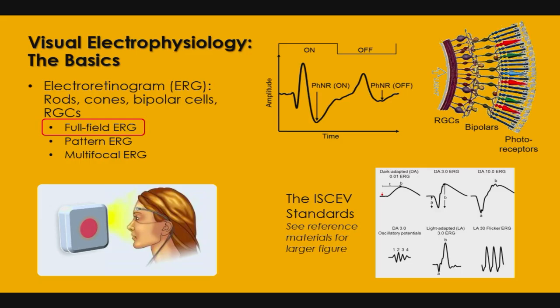Okay. Now, I mentioned something called the oscillatory potential. So this is a drawn out ERG, right? This is like your perfect of perfects, okay? The ones you will see down there will not look like this. They will have all sorts of wiggly things on them. You will see the general shape, but it will not be this smooth, all right?